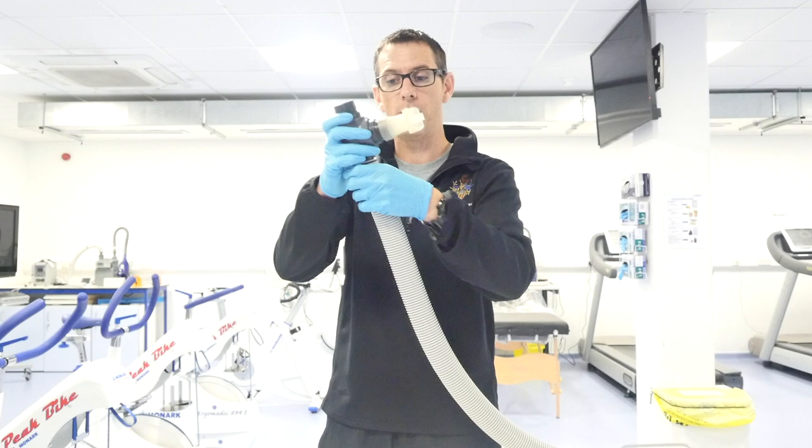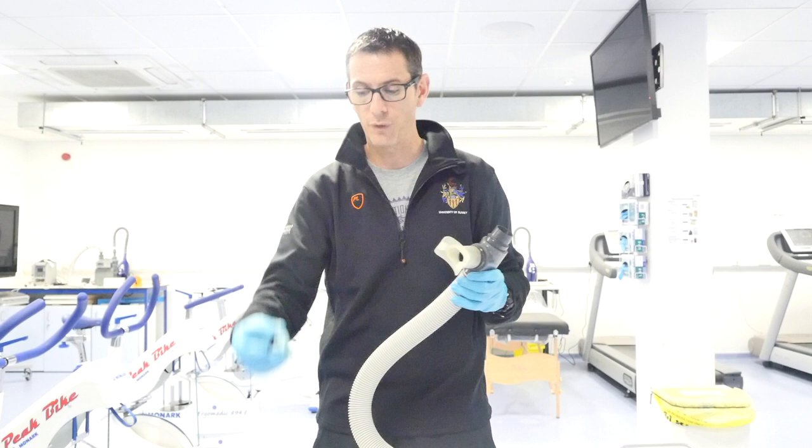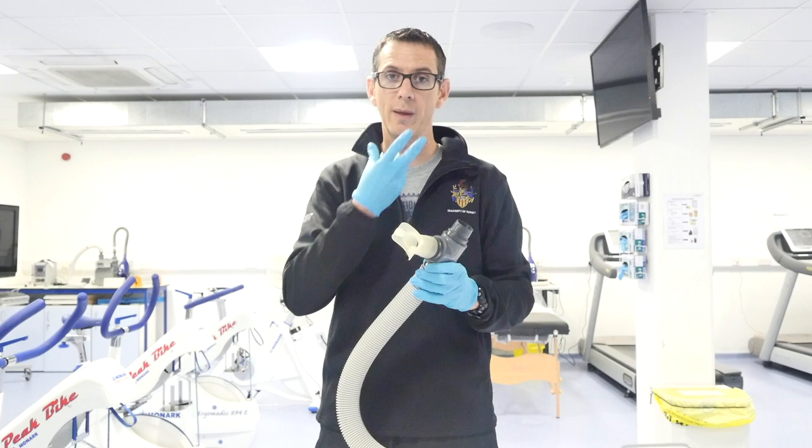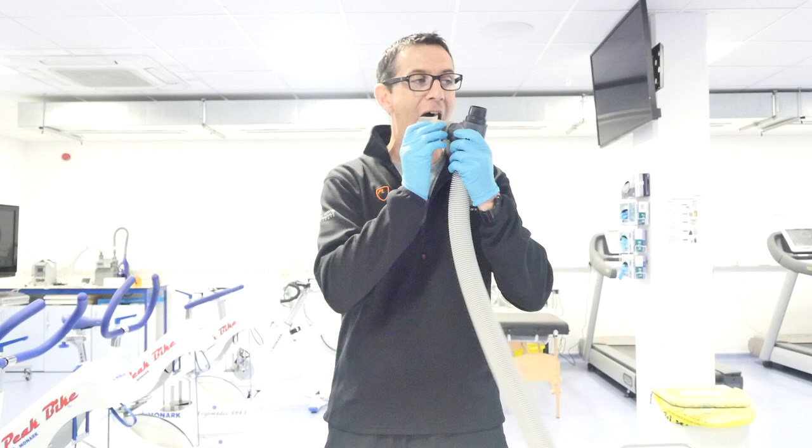So that's where we will collect - that's where we will pop our tube on. We breathe in, air draws into the system; we breathe out, it pushes it down, which will then connect with the Douglas bag. The participant will wear a nose clip on their nose to ensure they breathe in and out through the mouth. It's also important to note that when the participant uses the mouthpiece, all of this goes into the mouth.